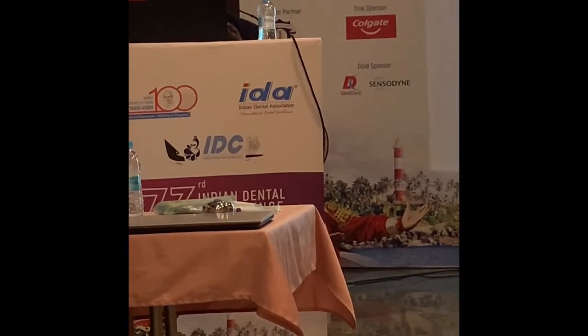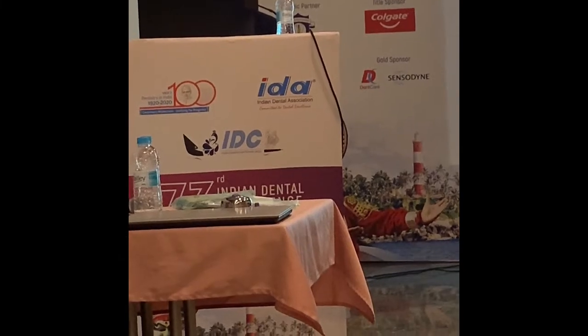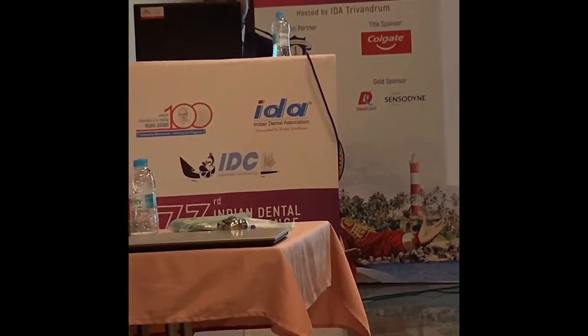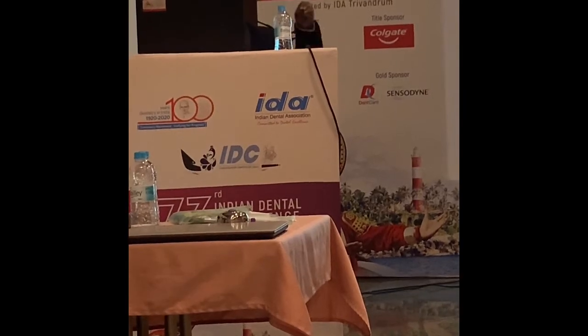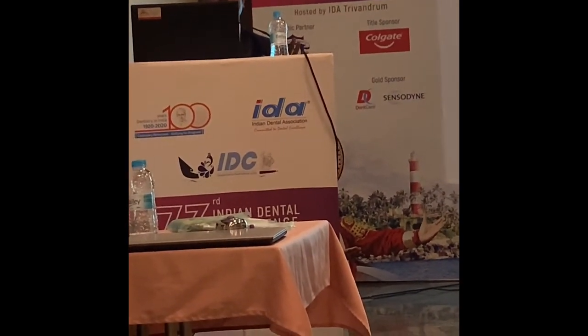So with this, we get a replica of the jig. When we take an impression, see, this is the implant analog. There is a duplicate of the implant which is inside the impression material. Above that, we put the die stone, and when we take it out, we have the implant inside. That is an artificial, another implant, a duplicate implant inside. And then we do it. Of course, occlusion and other things have to be considered properly if you want to give a successful treatment for the dental implants.